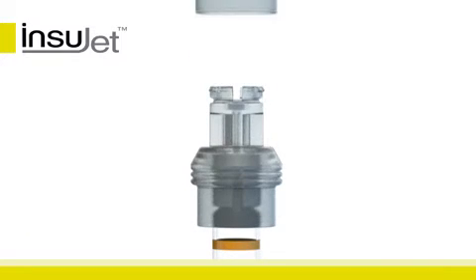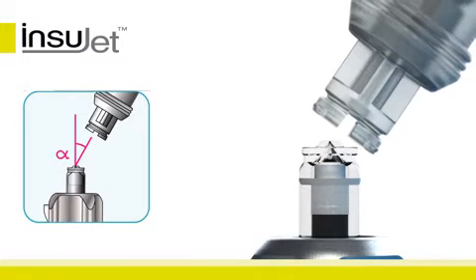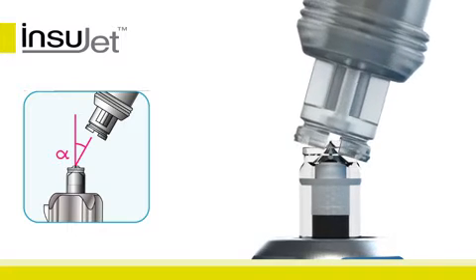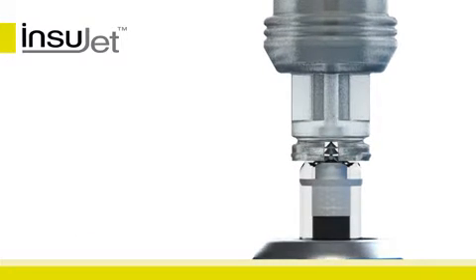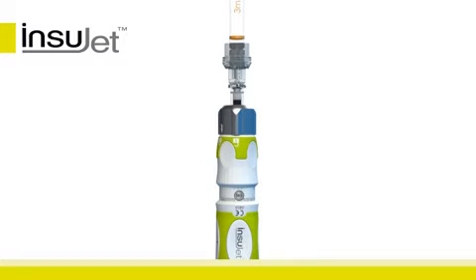Remove the adapter cover from the adapter and connect the adapter to the nozzle. Make sure to approach the nozzle at an angle before tilting the adapter upright. The adapter will snap firmly to the nozzle. The adapter and cartridge are now connected to the nozzle.